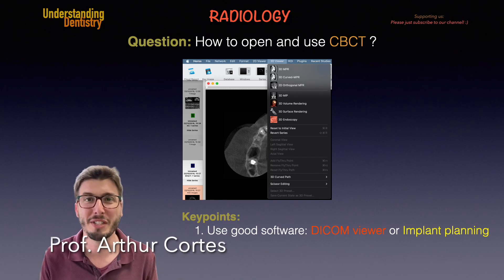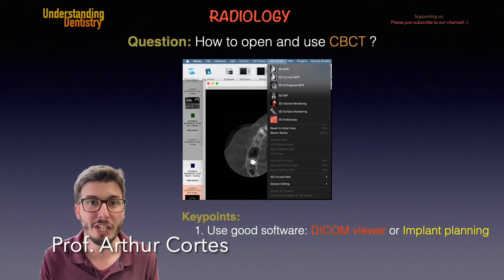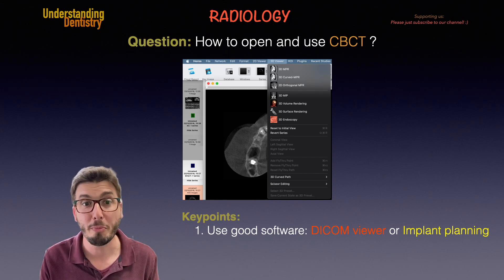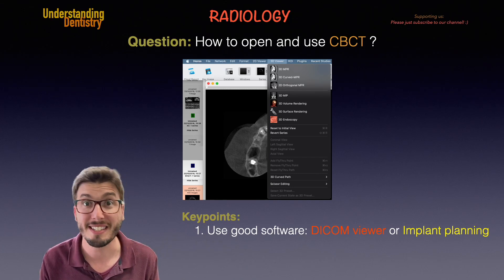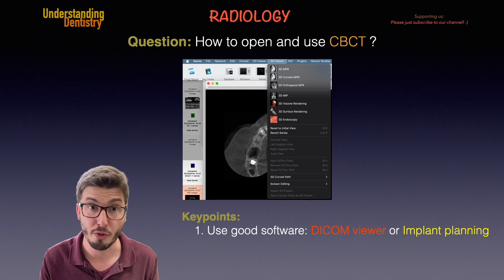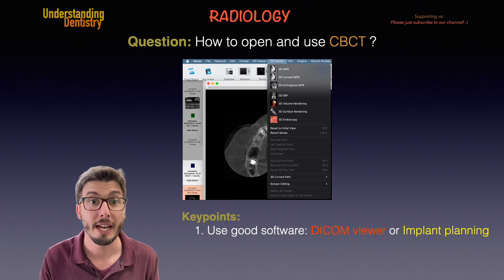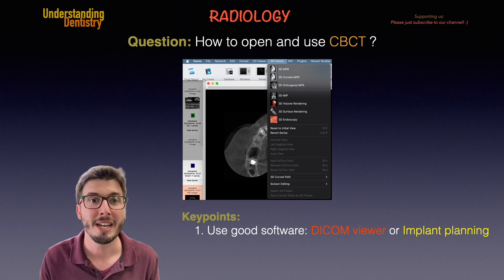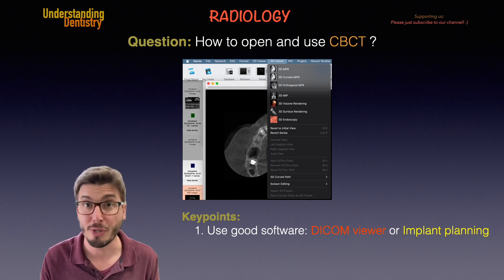Hello guys, and welcome to this video to learn how to open your CBCT scans on your software programs and how to use them to diagnose and plan your treatments.